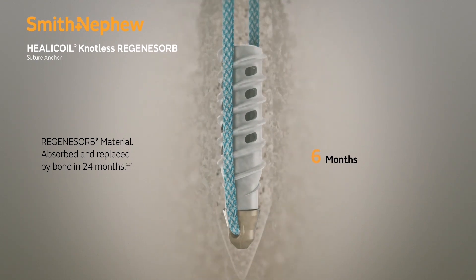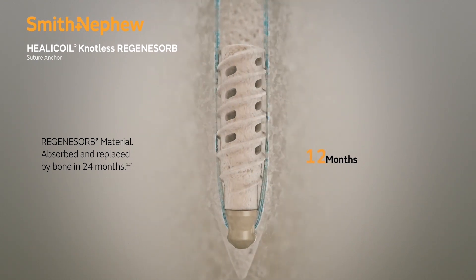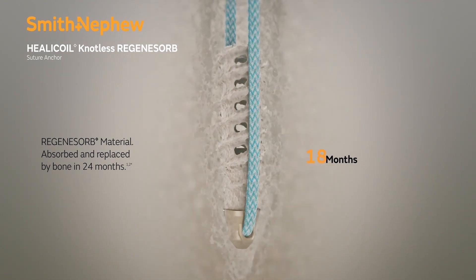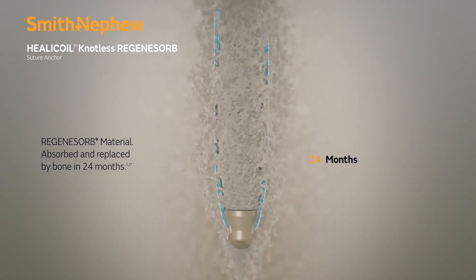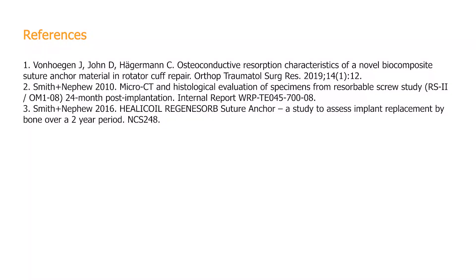At 6 to 12 months, the bone is integrating into the anchor nicely, and by 18 months, the anchor is nearly replaced by bone. At 24 months, the bone has completely replaced the anchor in its entirety.